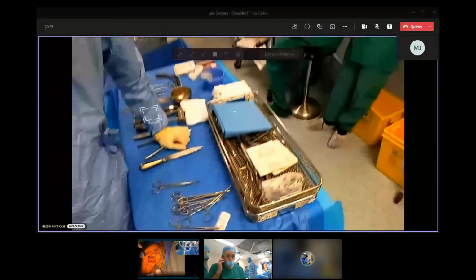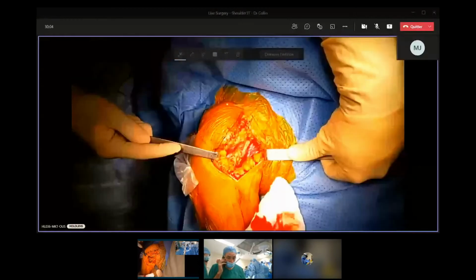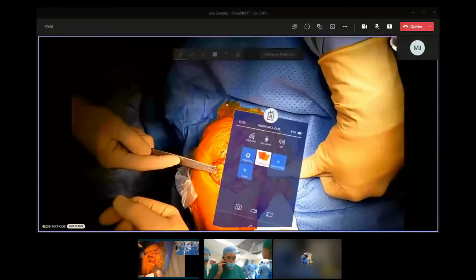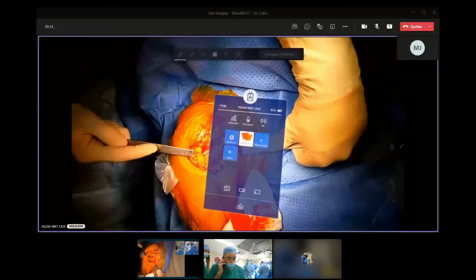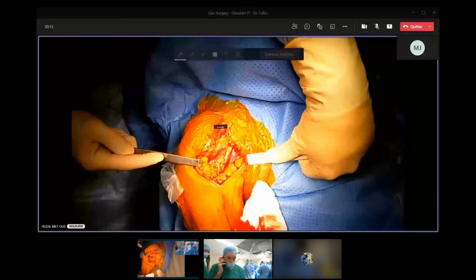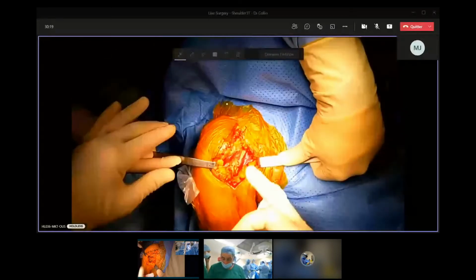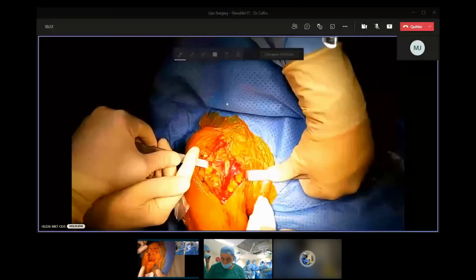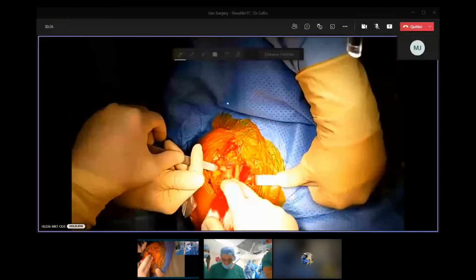So now we are going to be exactly with the HoloLens. It means that I should not move too much. Then you need to modify a bit everything in order to not have too much light into here.